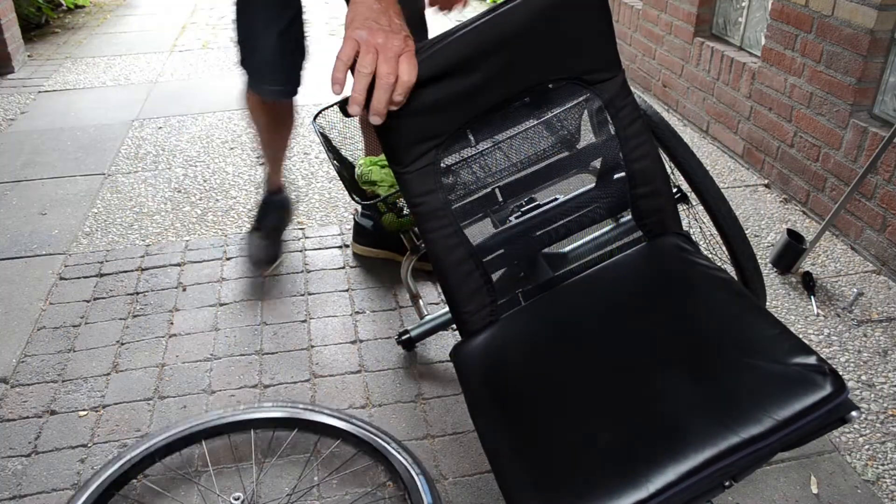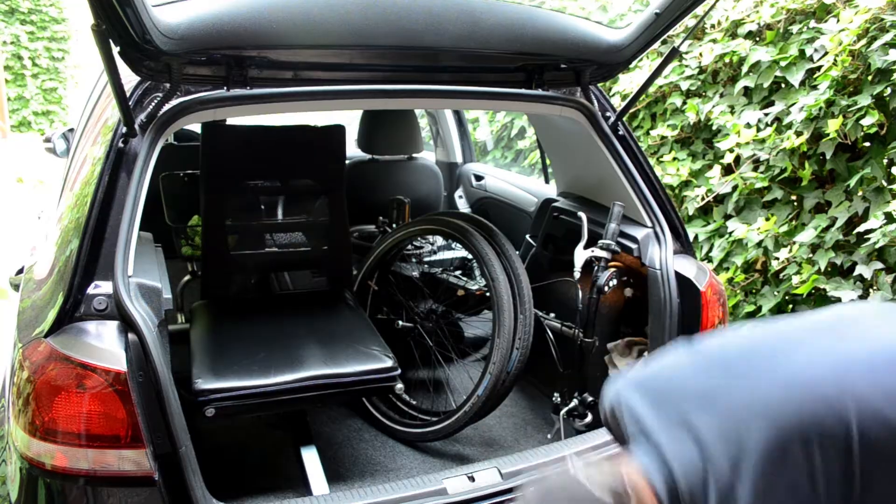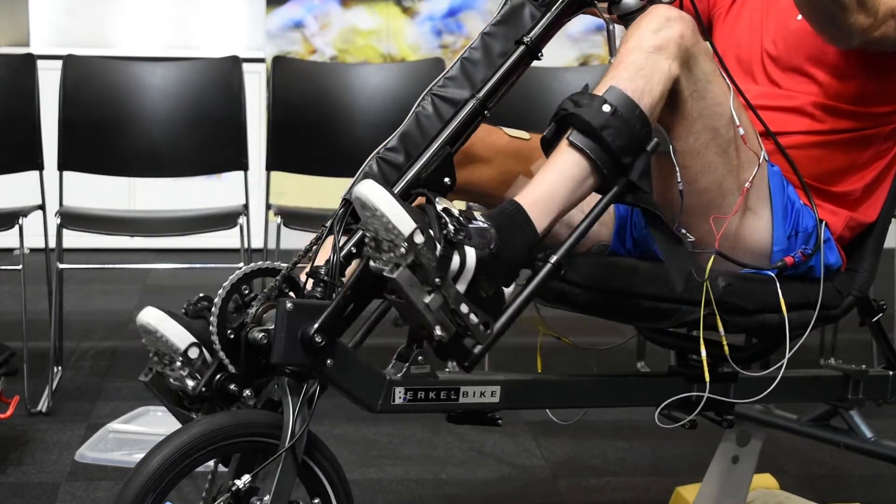Due to its low weight and fast disassembly, the BerkelBike is easy to take along in the car. The BerkelBike can be equipped with our functional electrical stimulation technology.